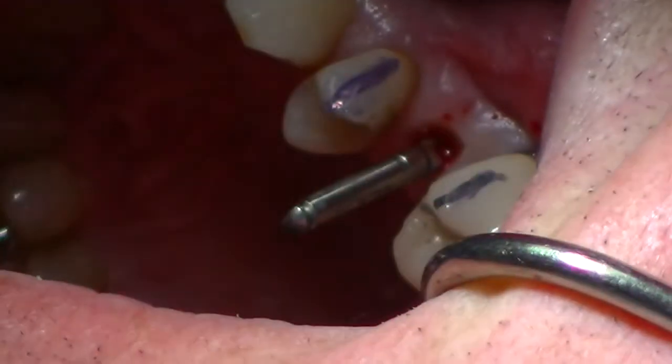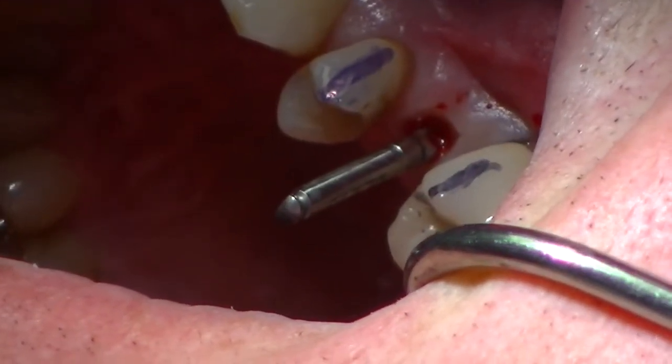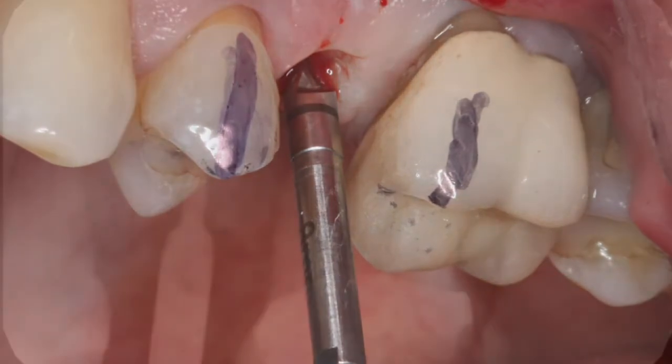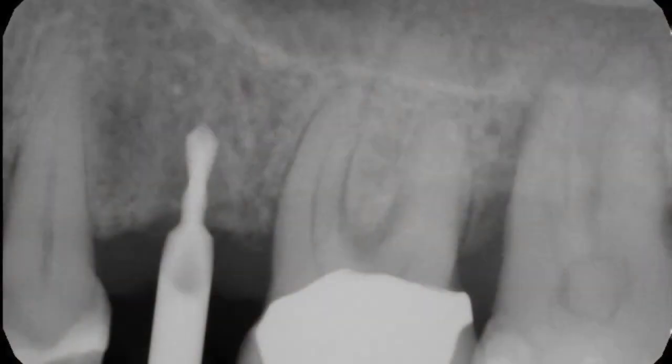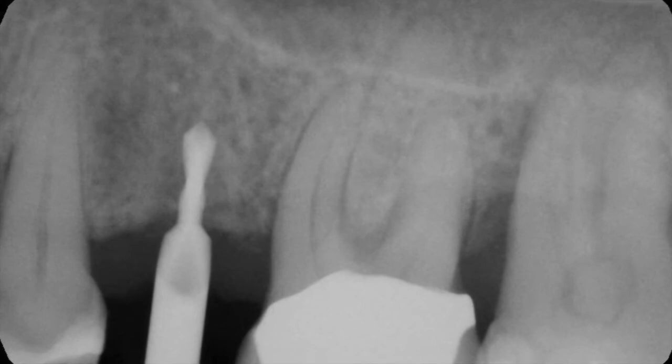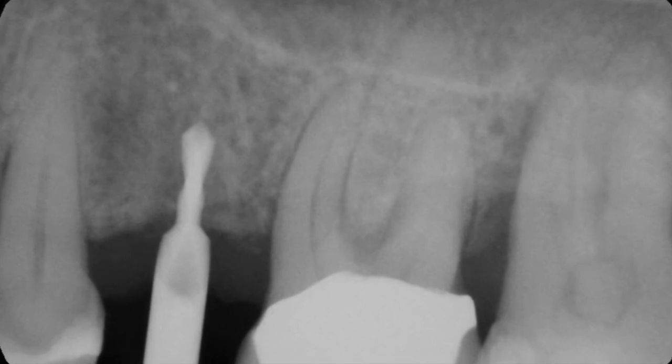I'm then simply taking that burr out of the handpiece, taking a digital radiograph, and looking at the position buccal-lingually. I like the implant to be pretty much center mesial-distally, and I'm looking at the dead space or the dark space mesial and distal to that burr. You can see that we're fairly in good position.